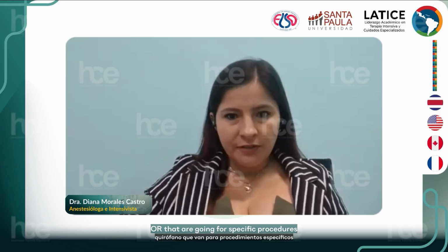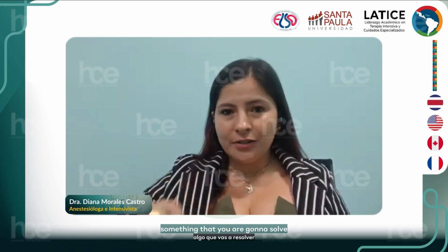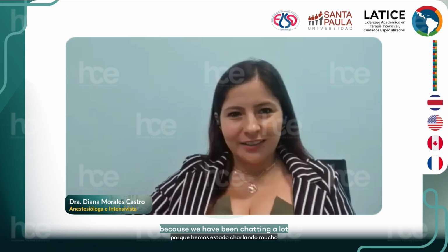Yes, and I will add, these are some of the patients that we are going to see in the OR going for specific procedures where you have very high risk, with intrathoracic masses, airway obstruction, etc., that you are going to cannulate percutaneously, sometimes without even sedation, for something that you are going to solve. And that actually opens up my first case, because we have been chatting a lot and we have a lot of questions from everyone.